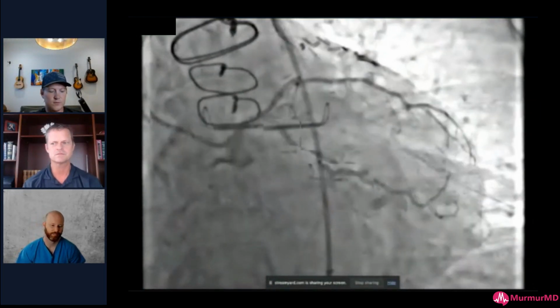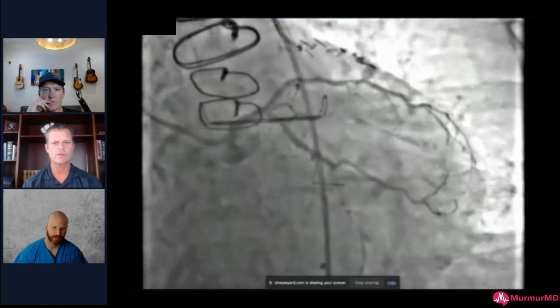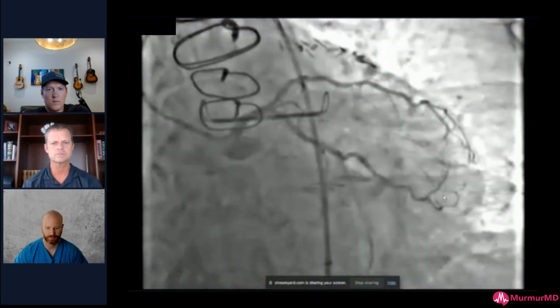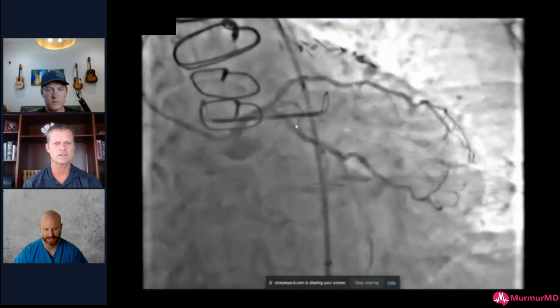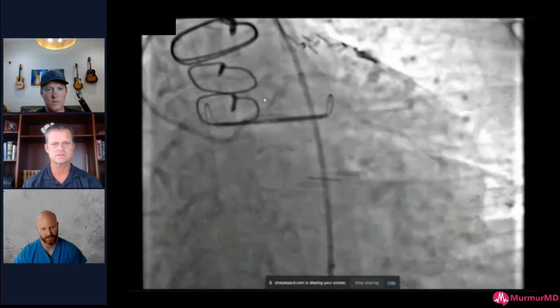Hey guys, I got a patient here with really bad angina. Interestingly, he has a bypass that looks really good. You can kind of tell there's a low-lying marginal system, but nothing to this marginal. He has a Lima to LAD that's patent. You can't really see it because of this arterial clip, but you can imagine that behind here there's some stenosis.